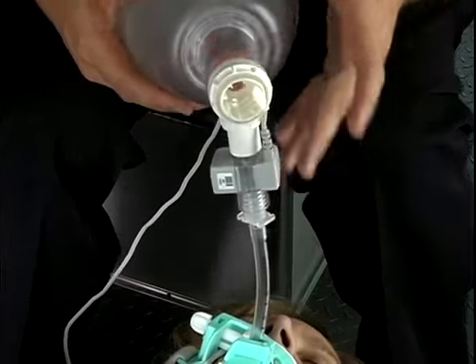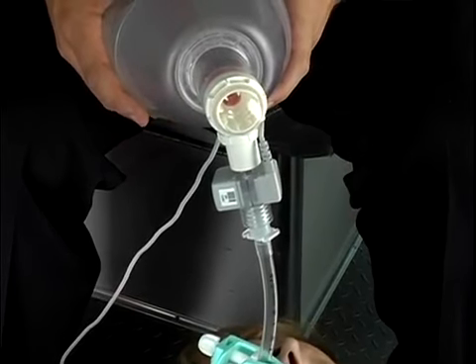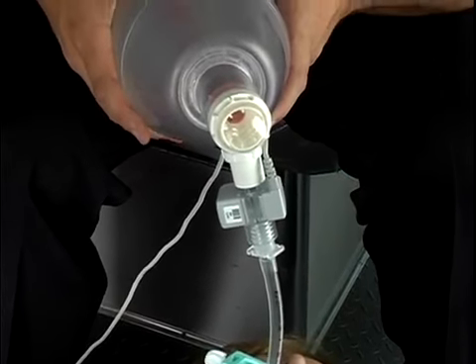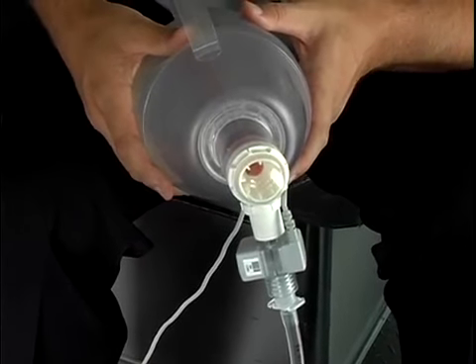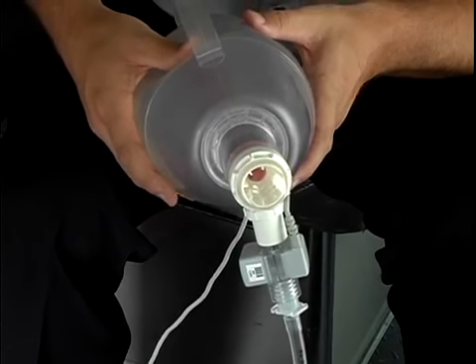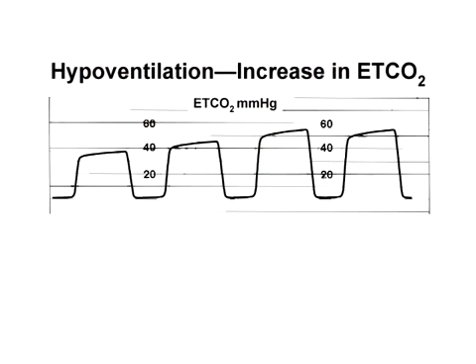Additionally, if the patient took any carbonated beverage prior to being intubated, CO2 will be present in the stomach as well. After several breaths, that CO2 will be washed out. After 3 to 6 breaths, if the ET tube is in the esophagus, little or no CO2 will be present. What could be going on here? We can see a gradual increase in CO2 on the capnogram.